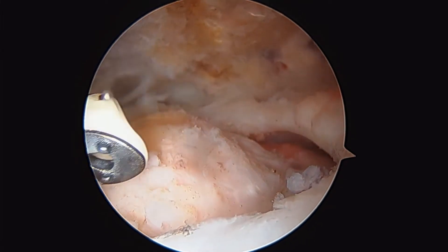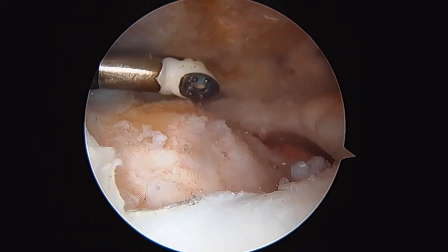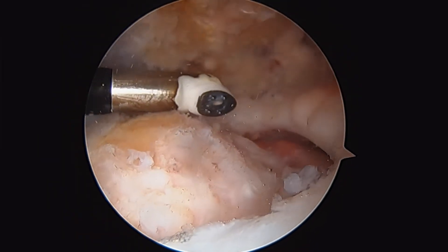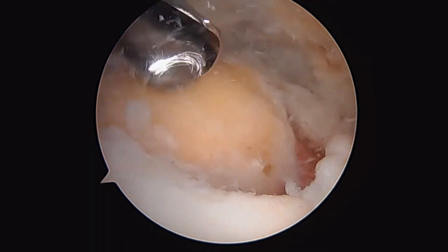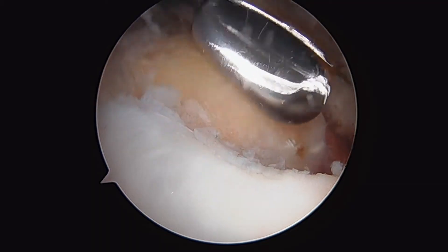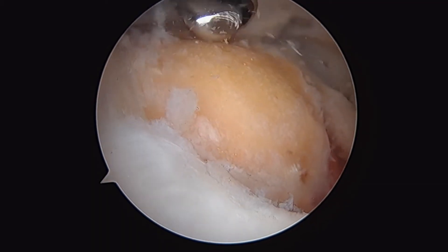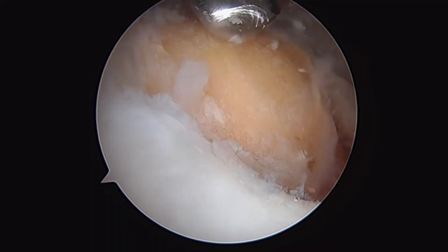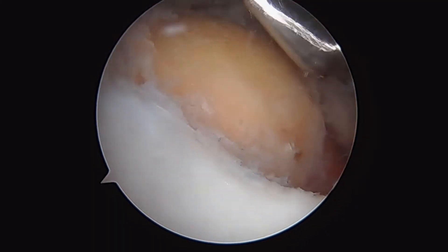We're going to gently shave this bone here on the humeral head, which stimulates some blood flow into the repaired tendon to help it heal back down into the bone. So this is us just preparing the humerus for our repair. All this soft tissue has been shaved down, and we're just gently contouring this area with our burr so that once we've repaired the rotator cuff, it's more likely to heal because we've stimulated some bleeding here from the humerus.